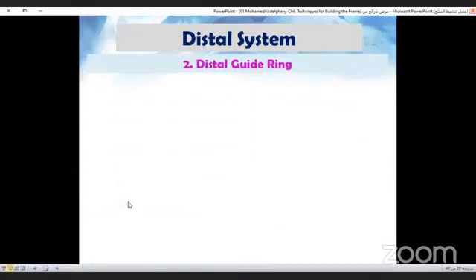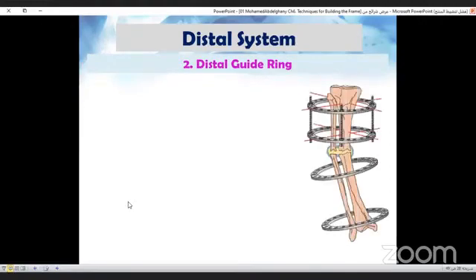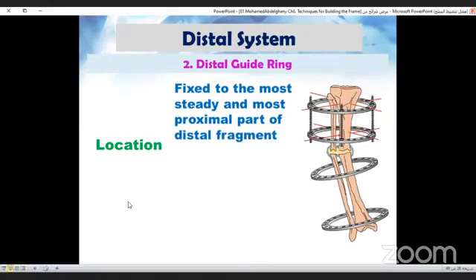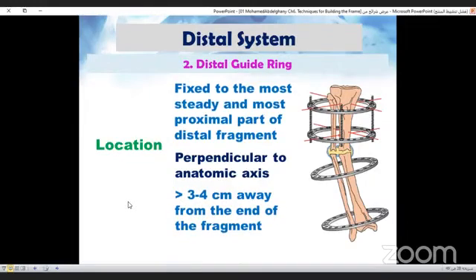Now we come to the second ring of the distal block, which is the distal guide ring. This has to be fixed to the most steady and most proximal part of the distal segment, perpendicular to the anatomical axis. And like its proximal counterpart, it is fixed three to four centimeters away from the end of the fragment.